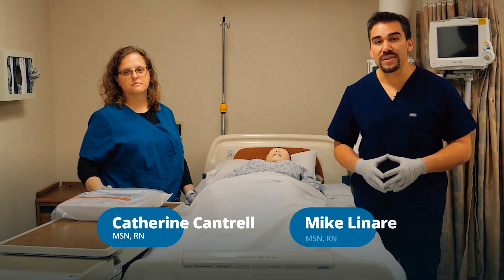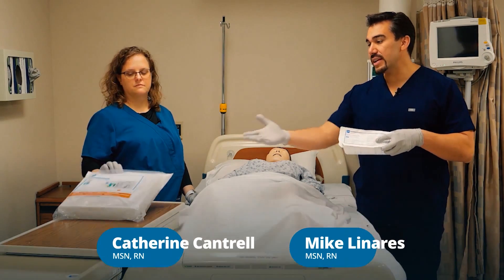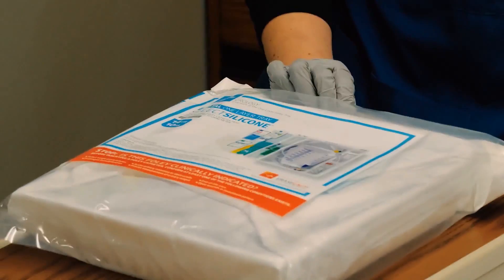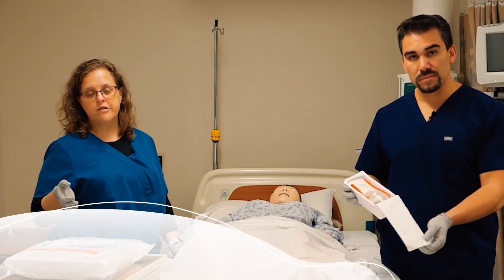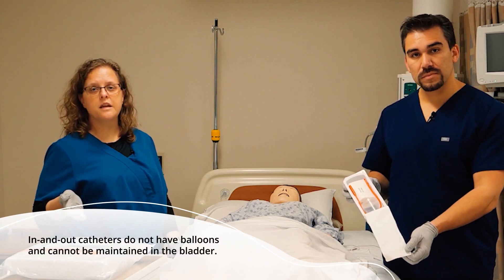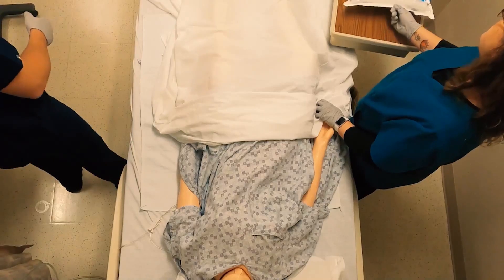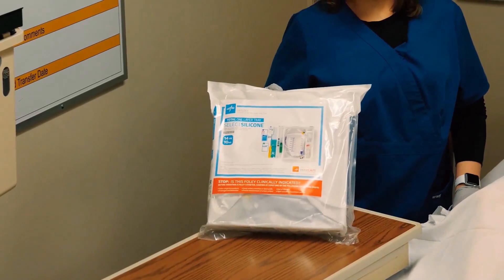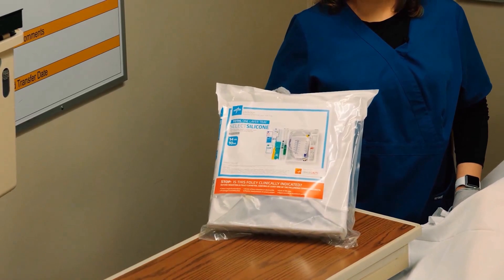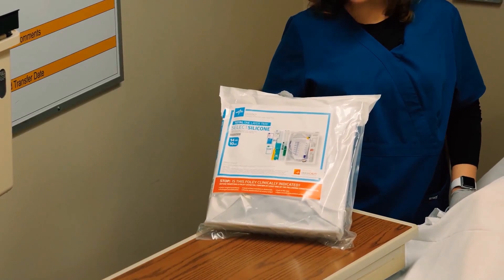Now we're going to talk about Foley catheters. We have an in-and-out catheter and also an indwelling catheter. An in-and-out catheter is for a patient who has a little urinary retention that you expect to resolve easily, or if you just need a specimen and your patient's not able to give you one. These kits can vary somewhat, but the package will tell you what's in there, and it's packaged so that you have the things you need first on top.